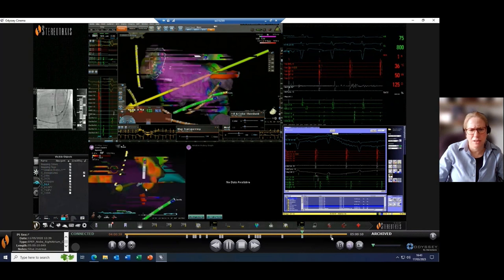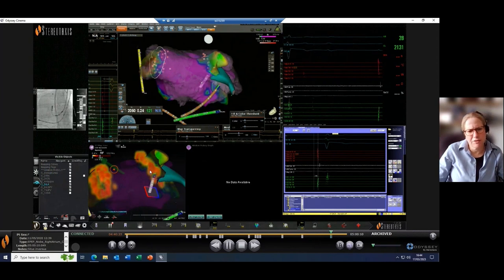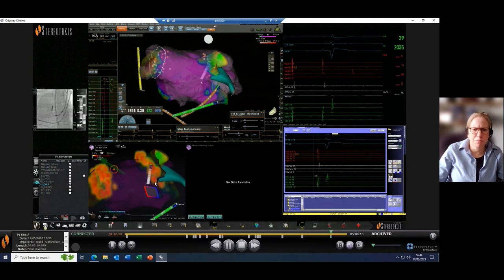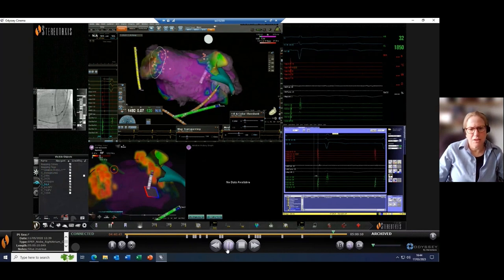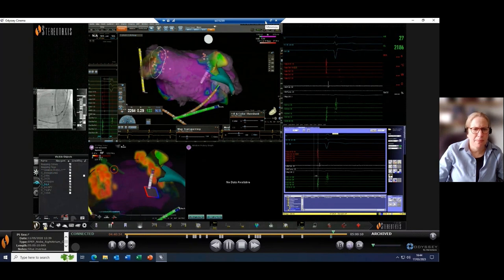I'll show you here the end result. This is a feature that you see down here that's called ablation history that shows you how much energy has been deployed via the catheter. It has a number of factors that are taken into account, and in any case, we mapped them in voltage afterwards, and they were isolated in the veins. So that was the first procedure. Unfortunately, this patient had a recurrence. Now, let me just quickly go back to my PowerPoint presentation, just one second.